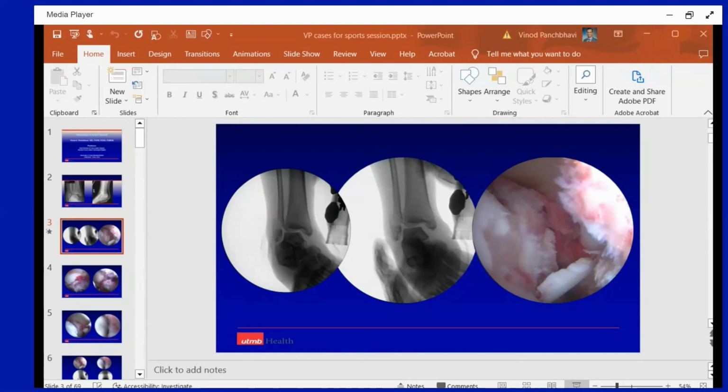So we put suture anchors, and I know increasingly folks are jumping on the bandwagon of repairing the deltoid ligament. I used to be one of those folks who never repaired deltoid ligament, thinking that we could either reduce the talus and the mortise by syndesmosis fixation or anterior and posterior fixation. But sometimes if the deltoid ligament is completely ruptured, I think to guarantee that it will not displace subsequently, increasingly folks are using deltoid ligament repair or deltoid ligament stabilization, I would say.